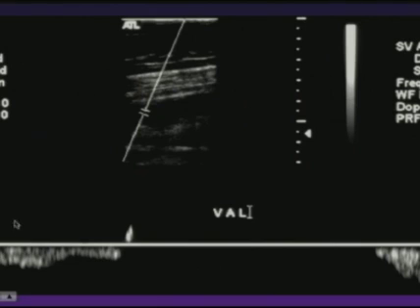This is an examination which is normal. You can see the normal flow within the vein, and then with Valsalva, there is a tiny blip of reverse component, and then no reverse flow at all, and then with release of Valsalva, the flow continues. Let's speak about this small reverse blip. The veins take some time to close, so as the pressure builds beyond the valve, the veins will leak a little bit, and then flow should stop. And a small amount of flow in the reverse direction is not indicative of reflux, and that is why we require more than a half a second of reflux, and values less than that are not significant.